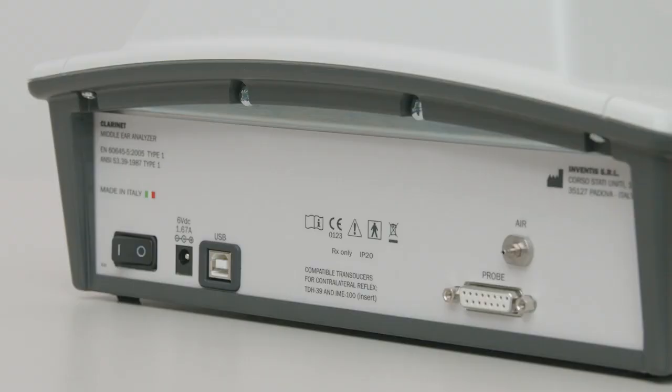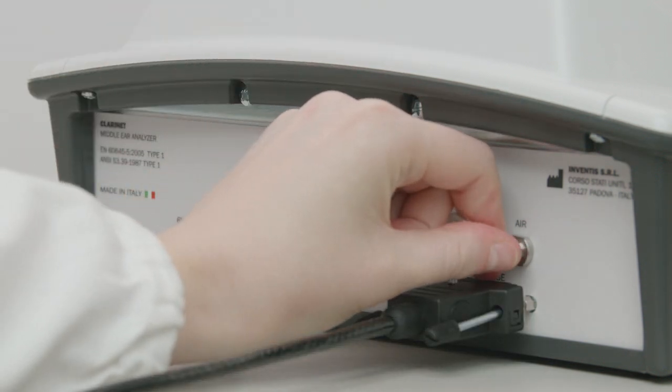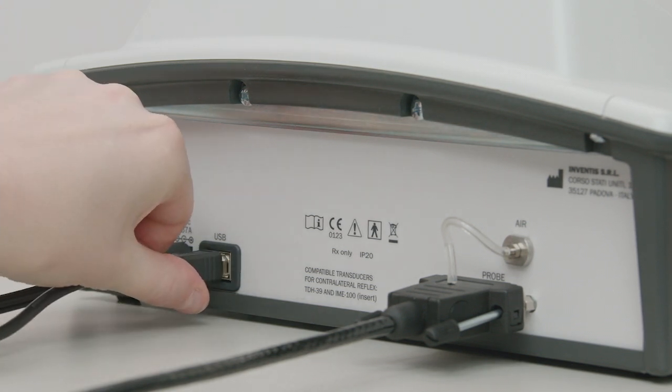All connection plugs for accessories are located on the rear panel. Plug the control box, the air tube and the USB connection cable into a personal computer.